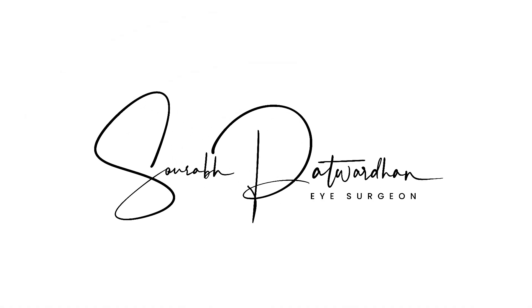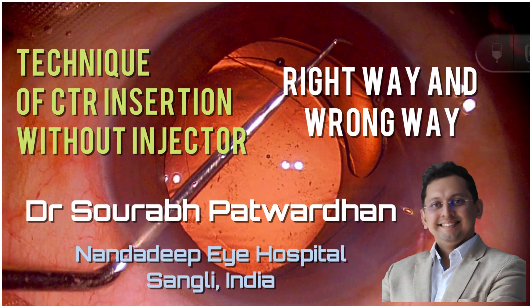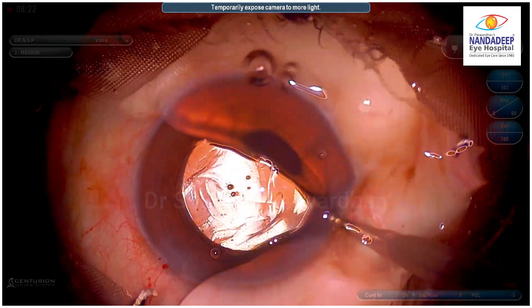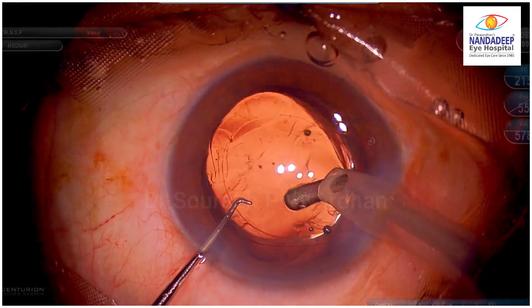This is an important video for those who are going for advanced FECO surgeries. In this video we will show you the technique of CTR insertion without an injector — the wrong way and what is the right way to do it.